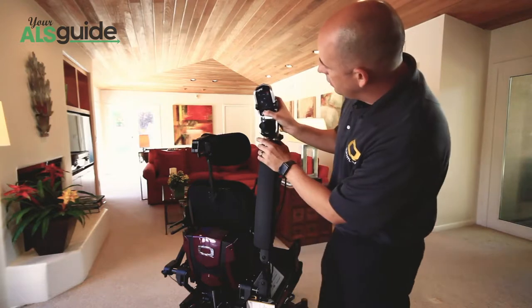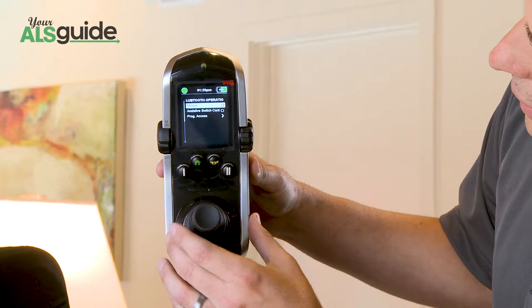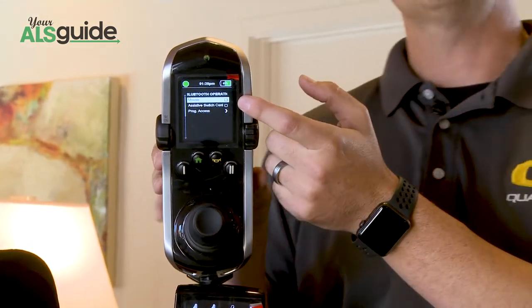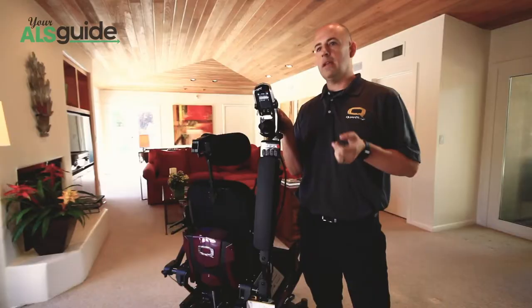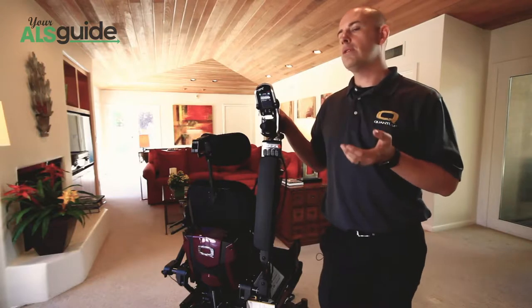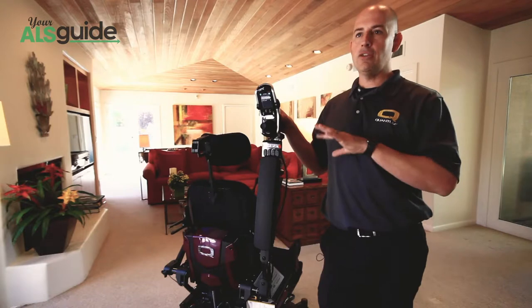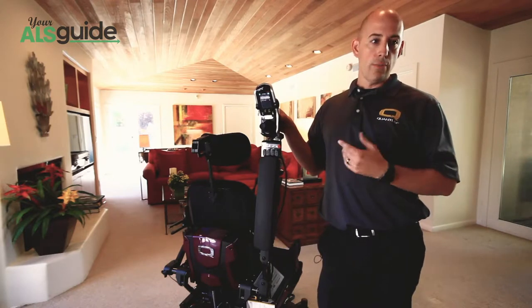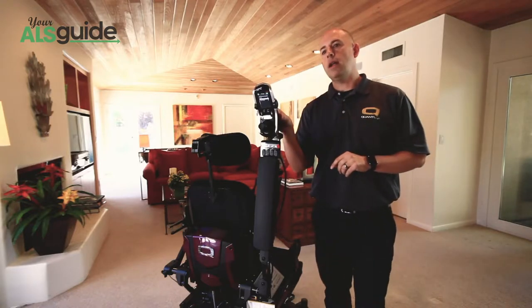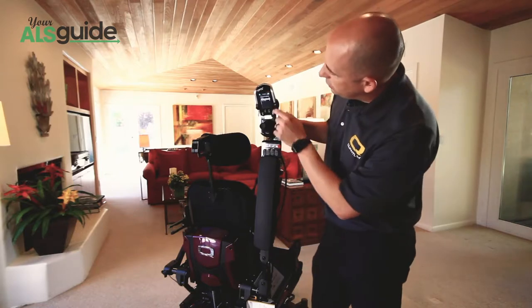So I will go into the Bluetooth mode here. There's a Bluetooth operation setting. And then you can see there's a couple of different choices here. Mouse is what's used for your Windows 8 and newer devices. So your computers, PCs, those type of units, laptops, Android, Galaxy, all use the mouse emulation. Assistive switch control is what's used for Apple products. So your iPhones, your iPads, iMacs. We'll use that assistive switch control.